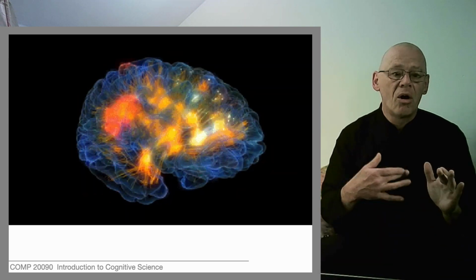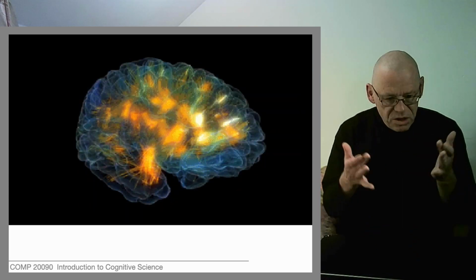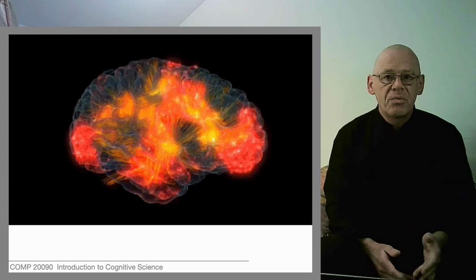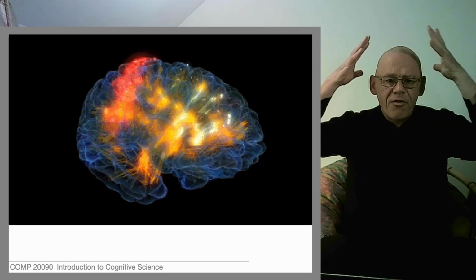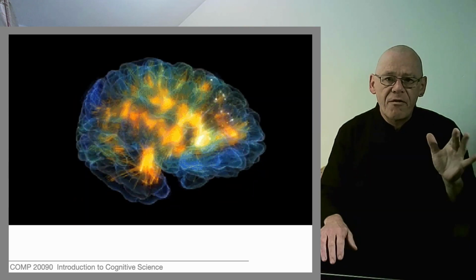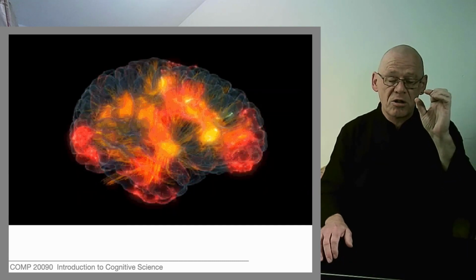The brain is always endogenously active. The brain is always creating electrochemical variation. And what the EEG records is wholesale electrical activity diffusely spread. And its origin is largely from that part of the cortex that lies, by chance, close to the skull.